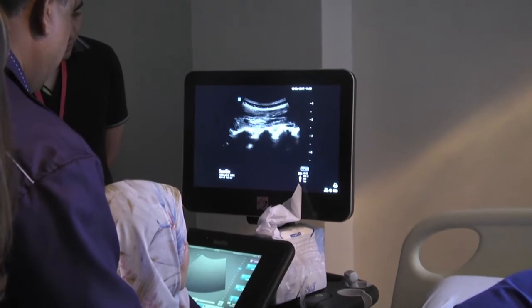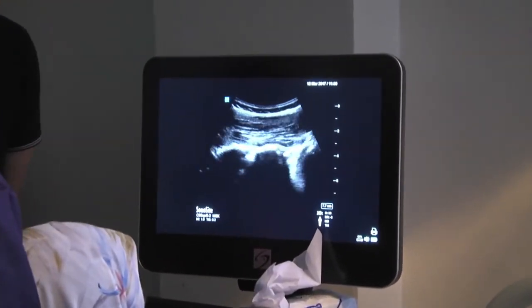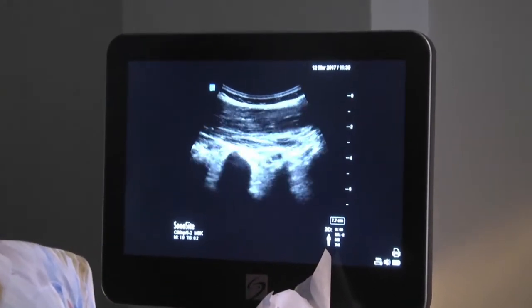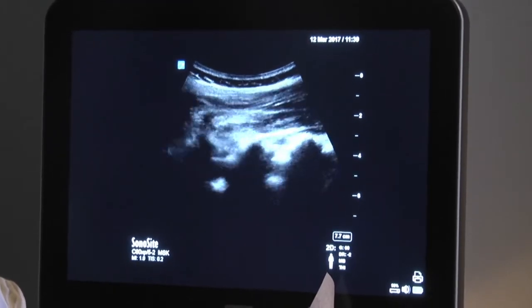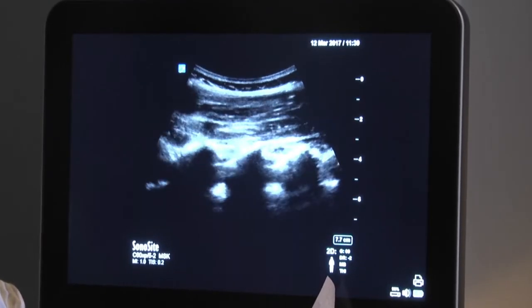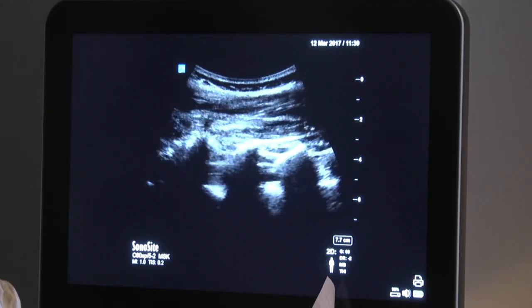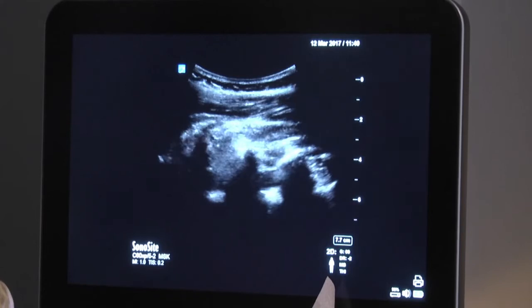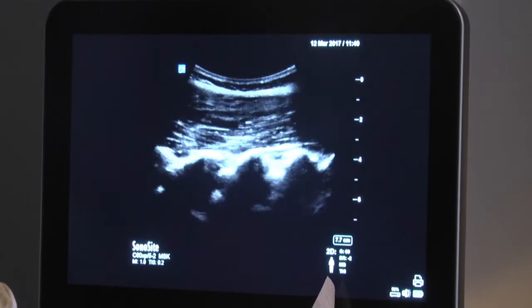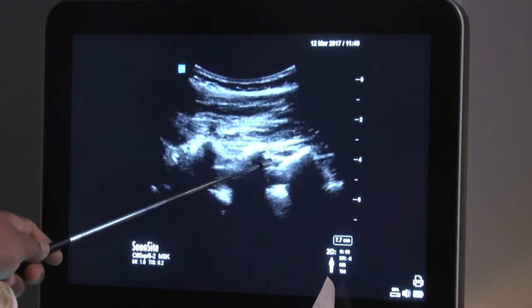You can see here. So you need to tilt it. There's also some slide. Don't look here. I want you to feel it rather than look at it. So you do a sagittal scan, oblique, but there's also some sliding motion. Can you see? Yeah. Now this is when it's much better. So this is the angle at which the beam is entering the spinal canal to the widest spot. So if you can keep that angle image still, this would be the ideal window through which you can enter the neuraxis, okay? So you can see the epidural space very clearly.